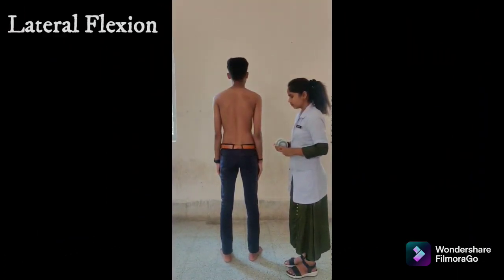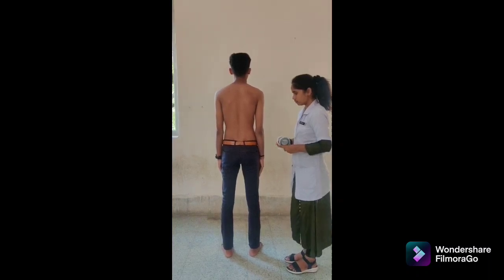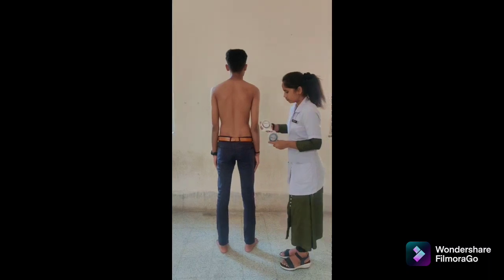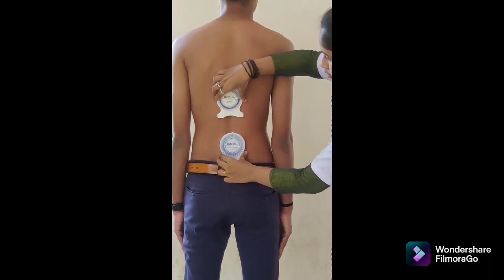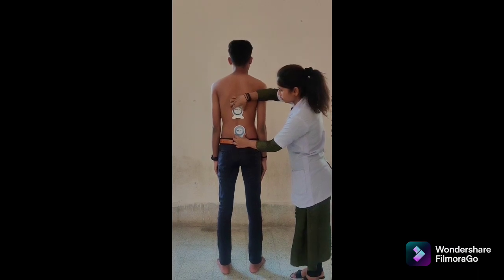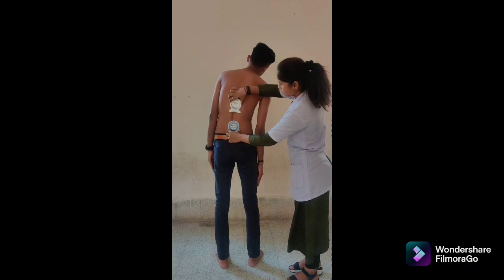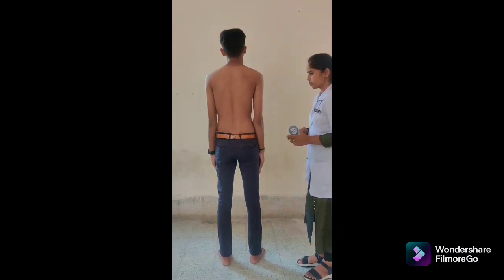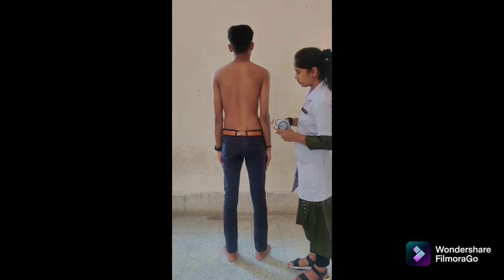There are two methods to measure lumbar lateral flexion. First is double inclinometer. Patient position: standing with feet shoulder-width apart. Inclinometer alignment: place one inclinometer over the spinous process of T12 and the second over S2. Both adjusted to 0 degrees. Instruction: bend the trunk laterally while keeping both feet flat on the ground and knees straight. Read and record degrees on both inclinometers. The difference between both readings is the lumbar lateral flexion range of motion to one side. Repeat on the other side. Normal range: 25 to 30 degrees to each side.